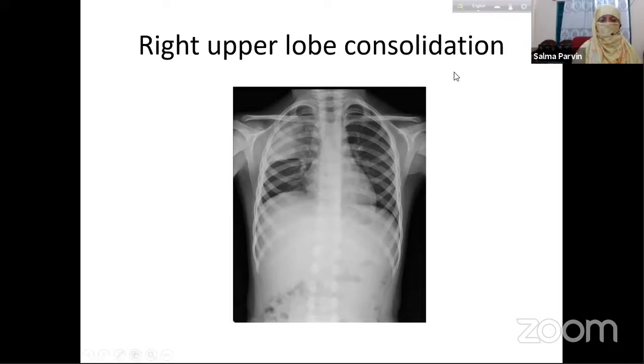Again, as I said before, the CP angles should appear at a similar position. It should have an acute angle touching the lateral chest wall. The left hemidiaphragm is reaching the left lateral chest wall and producing an acute angle. But what about here? The right hemidiaphragm is not reaching the right lateral chest wall. It ends a bit before it reaches the right lateral chest wall. There is an obtuse angle here. I cannot see well here.